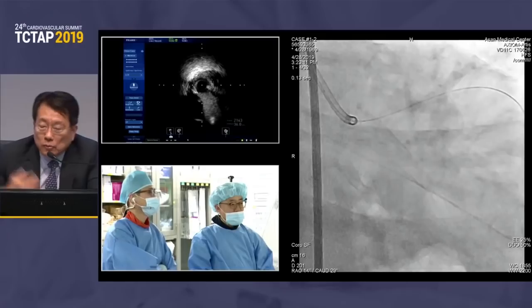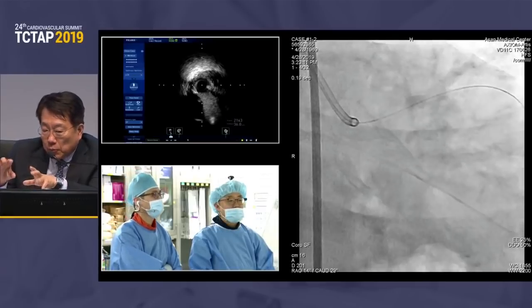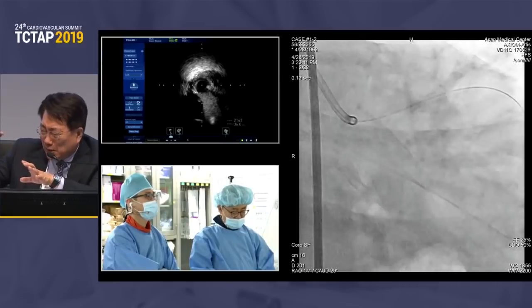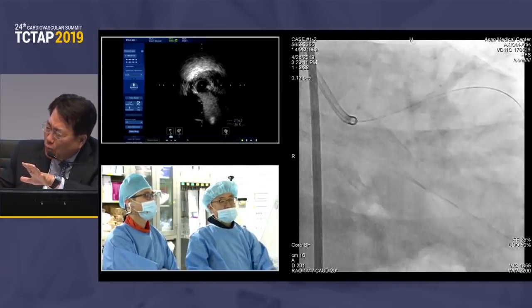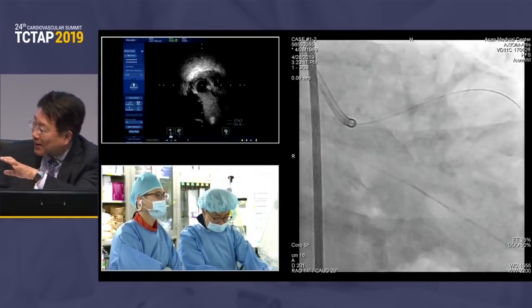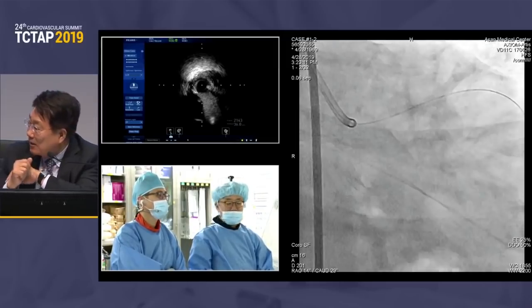To be honest, I want to do the two stents. Especially for this particular case, there is some calcific disease in the region of the circumflex ostium. If you do a single stent crossover, there are more complicated things, right? And so I don't want the complicated one. So just do the circumflex stent first, and then the LAD stent, which is procedural-wise very perfect. More easier, more safer. That is my opinion.